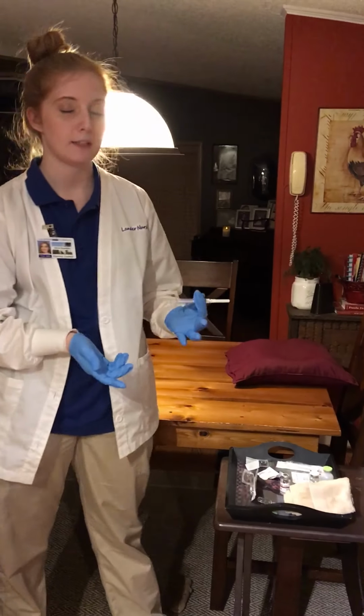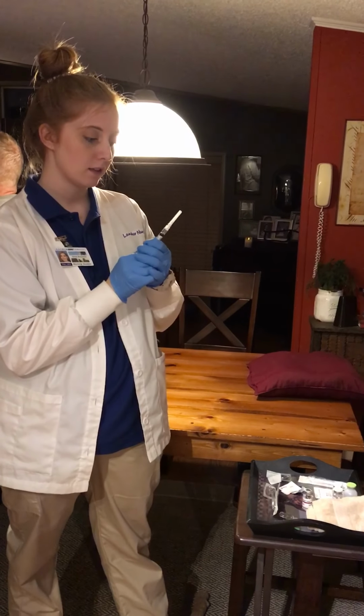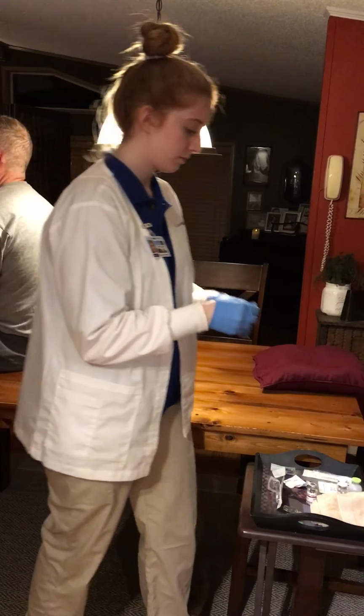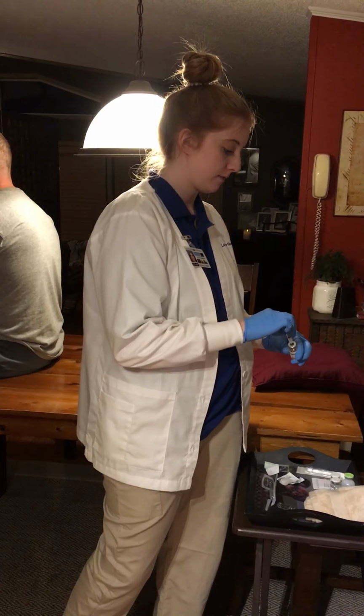Okay, I'm going to be injecting 1 milliliter today, so I'm going to draw 1 milliliter of air. I'm going to check that.